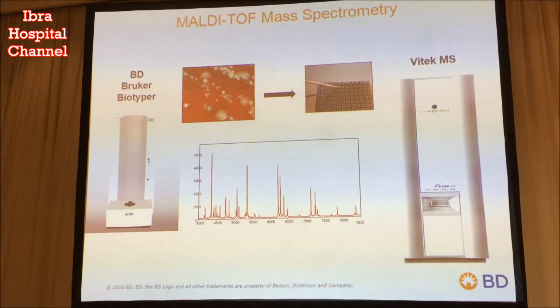We started working with mass spectrometry, and I was partnering with Bruker in the work that we were doing. The original mass spectrometer that we used was probably about 6 feet long, and it had to be put horizontal on the floor rather than upright because it was actually too big. They've obviously made a lot of changes in the mass spec systems that we use today, but the work that we were able to do with the system was really dramatic.